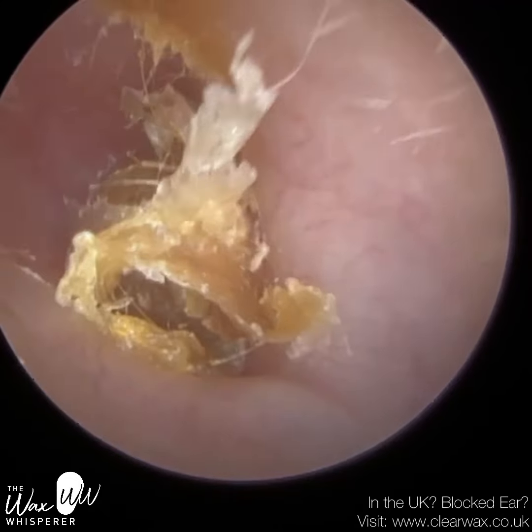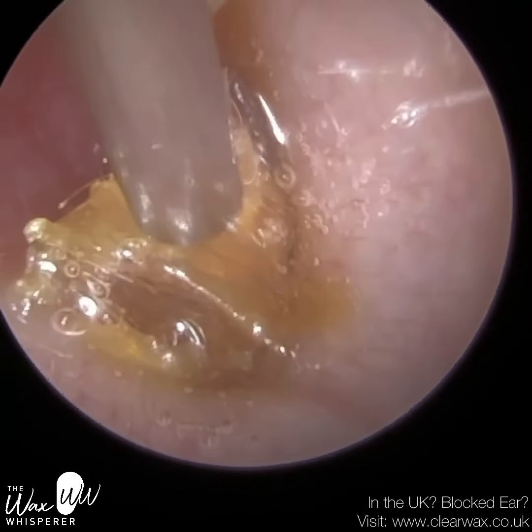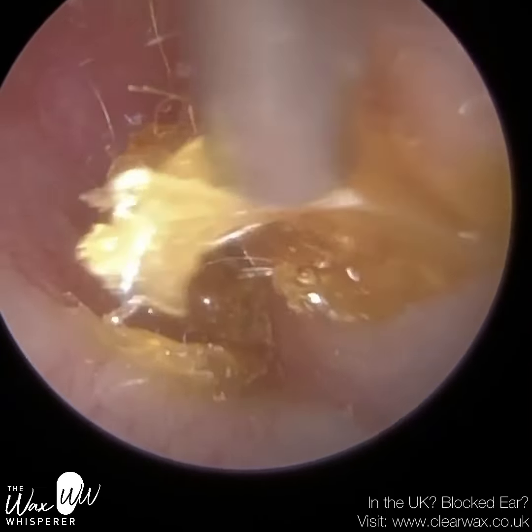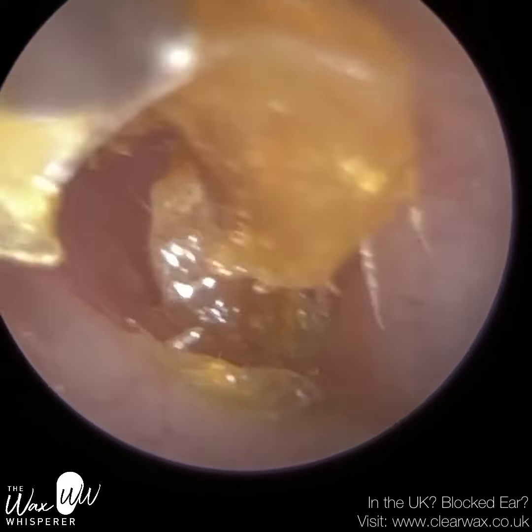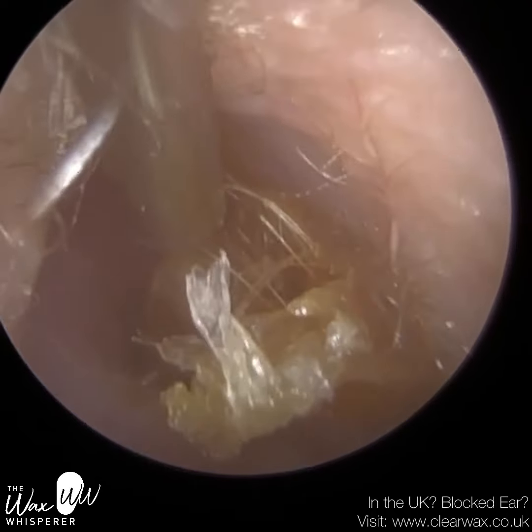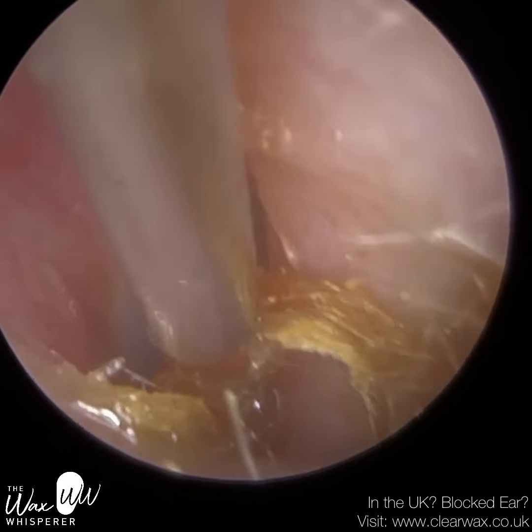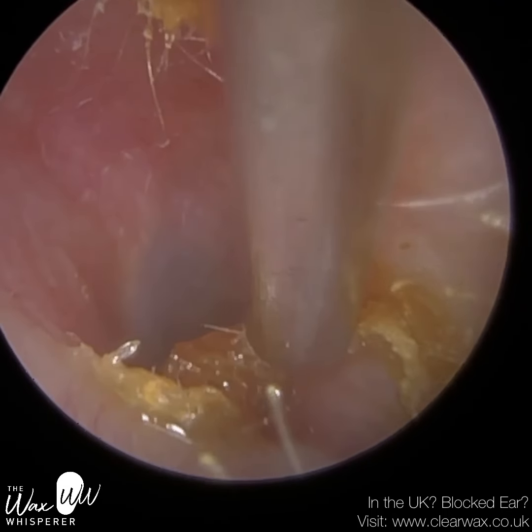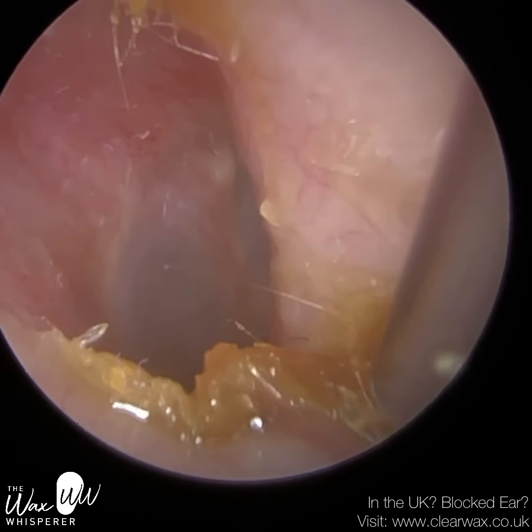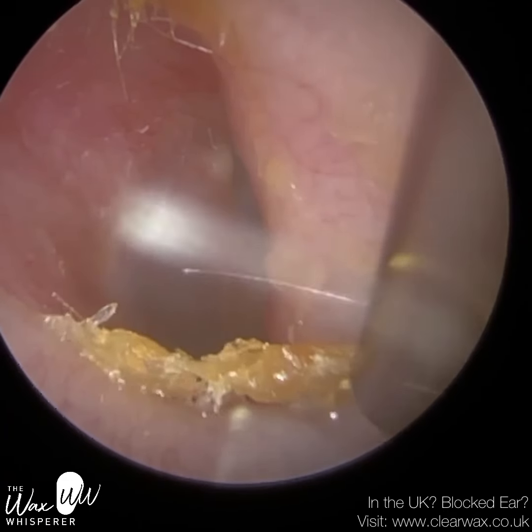So I've more or less loosened this. I'm getting a bit of clarinetting there, so I had to put some oil at that side. Clarinetting is when you suction skin and it can violently flap at the tip of the suction probe, emitting a very loud, high-frequency squeal. It's loud for me as well doing the procedure, so you can just imagine how loud it can be for the patient — we want to avoid that. So the oil just helped. I'm just peeling this off the bottom of the ear canal, slowly coming away, and you can see the eardrum there — that's nice and clear.